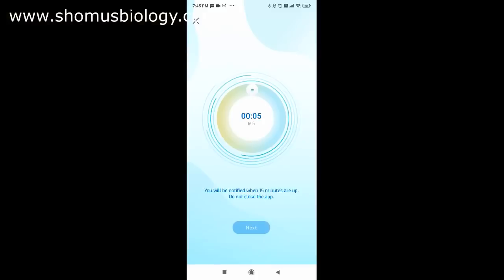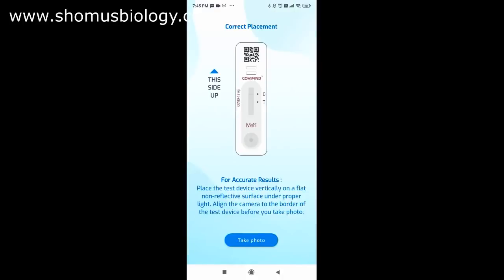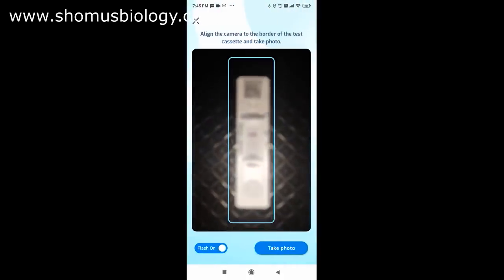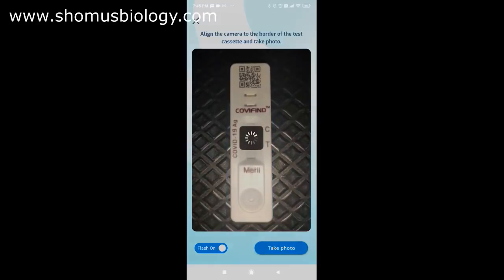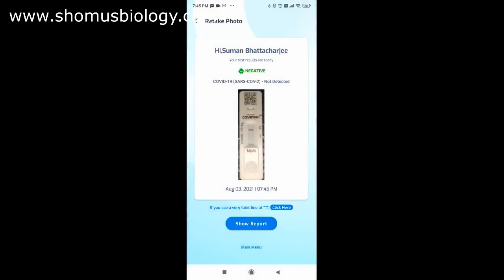We're now at the end of the 15-minute detection period — the timer is over. You now need to take a photo of the kit inside the app. Place the cassette against a dark, non-reflective background for accurate results. Click 'Take Photo' — the flash is on. After taking the photo, the app displays 'Negative' at the top. It also asks if you see a faint band at T — in this case, no. Then simply click 'Show Report.'